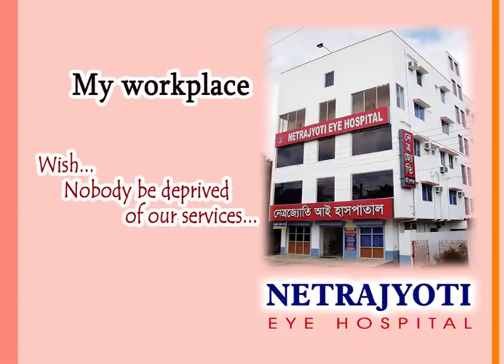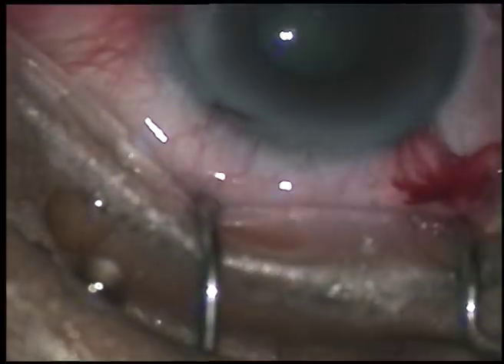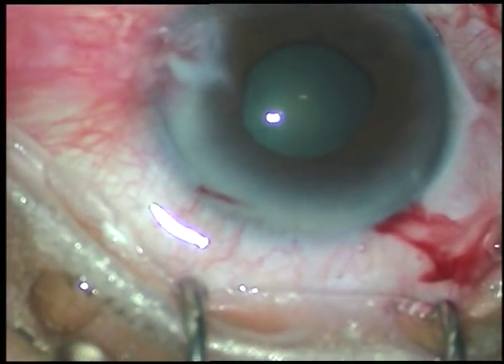Friends, welcome to my hospital at Rana Ghat, India. This is a small pupil phacoemulsification and this is the B-Hex pupil expansion device being applied.